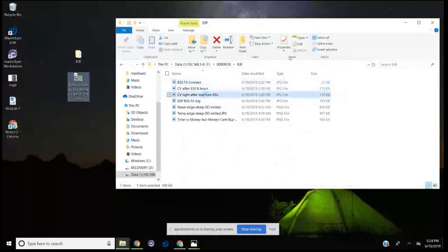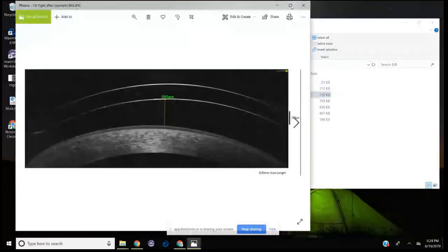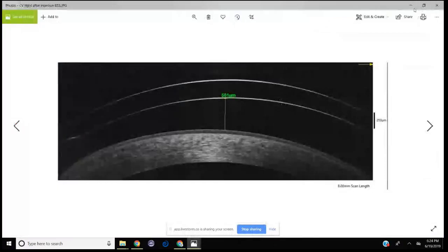Remember that when it first went in, the first trial lens was too high, 500 microns. So Brad, I'm sorry, Tom, that was a diagnostic lens, right? Yes, correct. This is only the diagnostic lens that I use to over-refract. Good. It was predicting that the diagnostic lens needs to come down 200 microns.